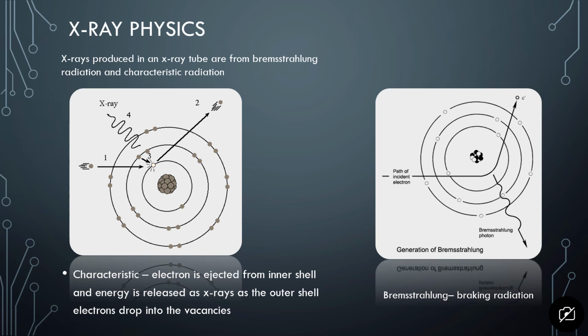The energy actually will get absorbed by the atom, and then the atom releases that excess energy as an X-ray. These are usually low energy X-rays, and they're not really what we want for imaging, but it just occurs because of the electrons interacting with matter.